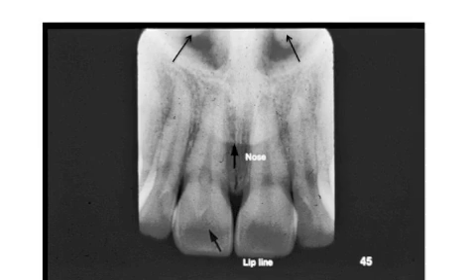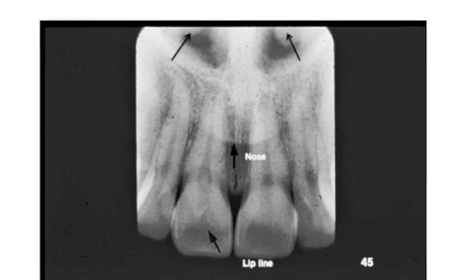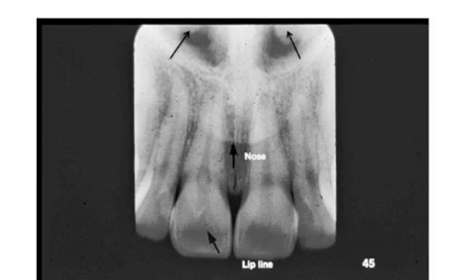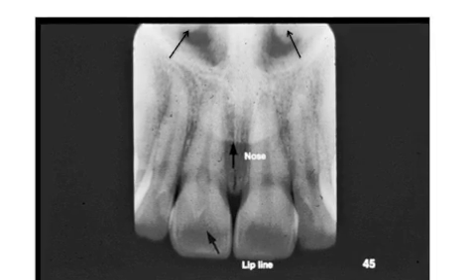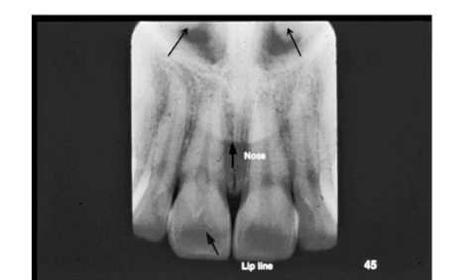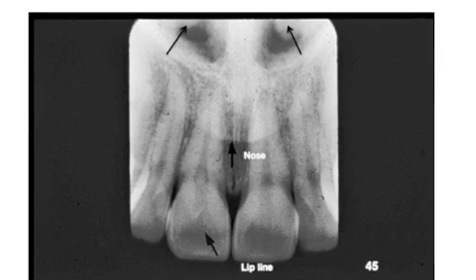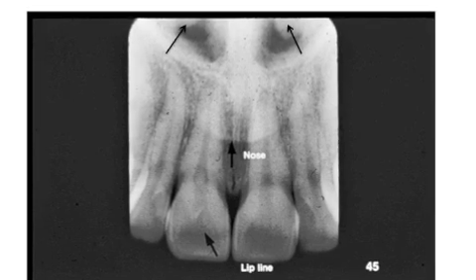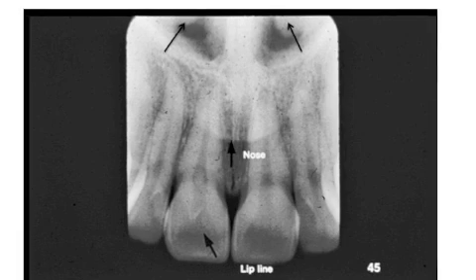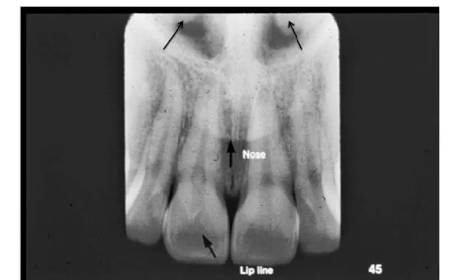The upper arrow points to radiopacities of thin shell-like bones, the inferior nasal concha, inside the radiolucent nasal fossa. The nose line is particular to an individual and may not always look this shape. It is a faint radiopacity showing the outline of the soft tissue of the nose. The lip line is a faint opacity over the crowns of the teeth showing the outline of the lips.